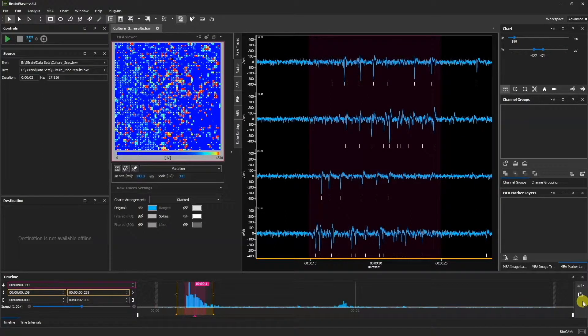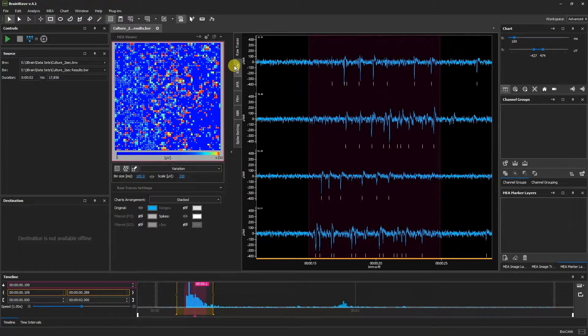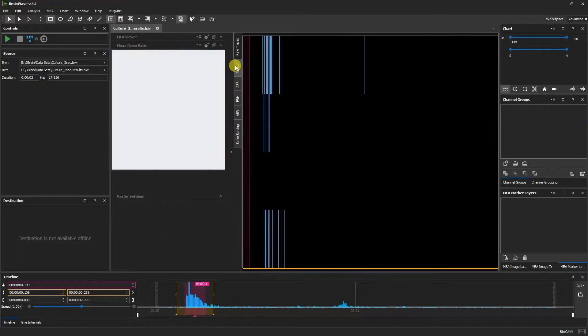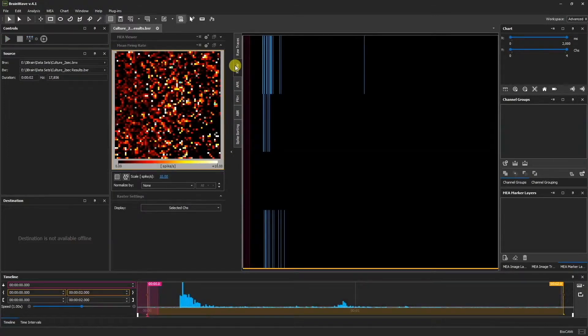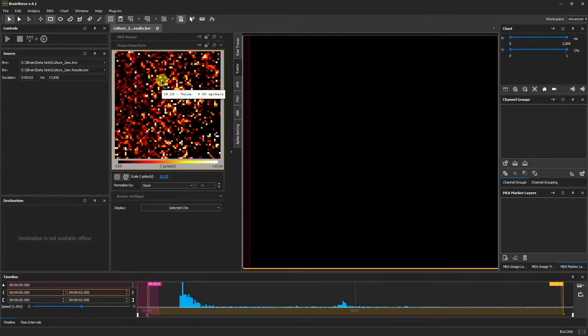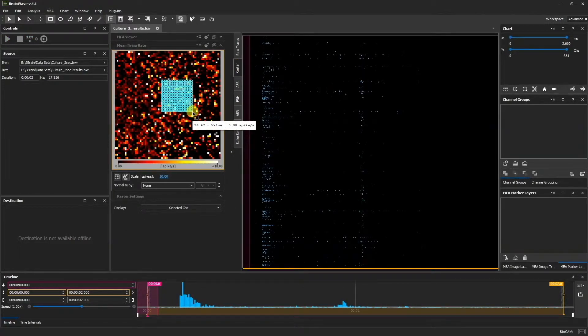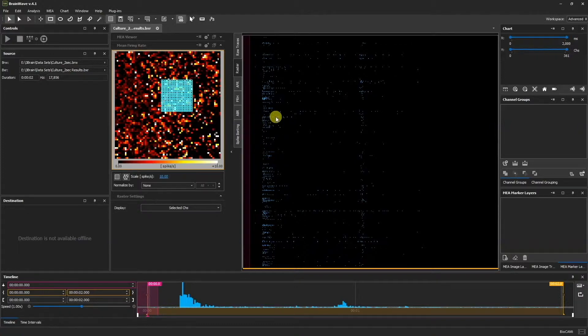In addition to the Raw Traces chart, we can also open the raster plot. By clicking and dragging a selected group of channels, we can see the spikes detected over time.